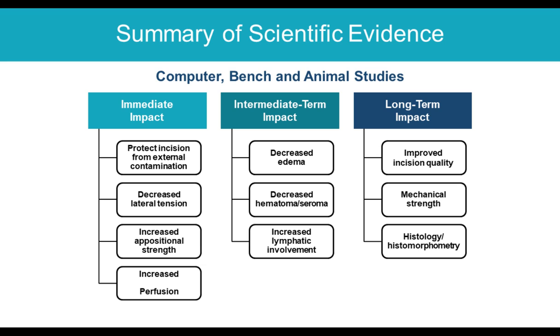But over the first several days after negative pressure is turned on, we're seeing decreased edema, less swelling, lower rates of hematoma and seroma, and an activation or an increase in the lymphatic involvement. And then after we've taken these dressings off, after the first week, if we follow these incisions further, we're seeing improved incision quality, greater mechanical strength, and some positive changes in histology and histomorphometry. So I think we're not sure which of these is responsible for the benefits that we see with negative pressure, but it's probably some combination of all those.